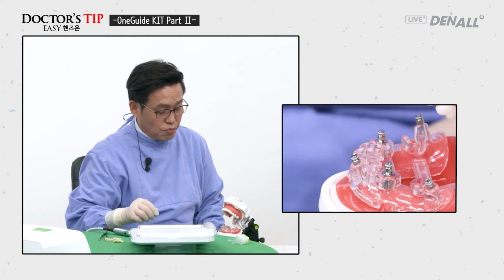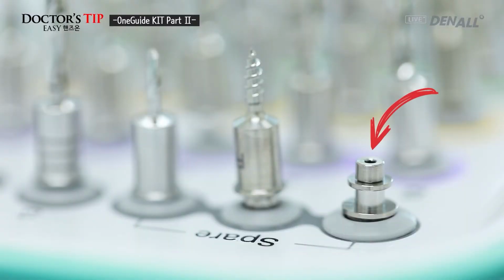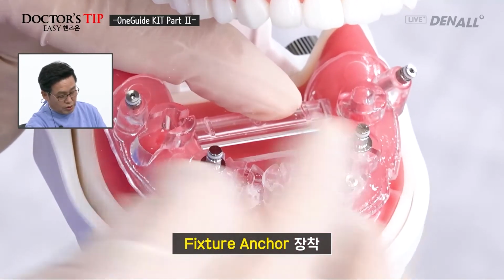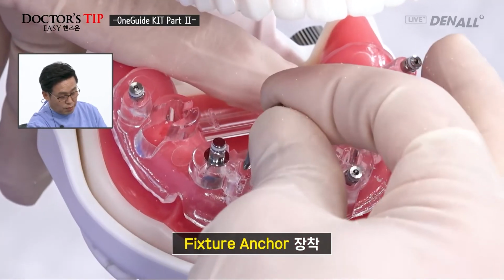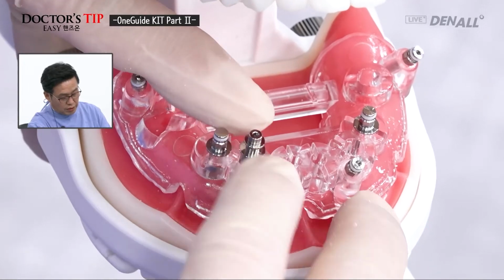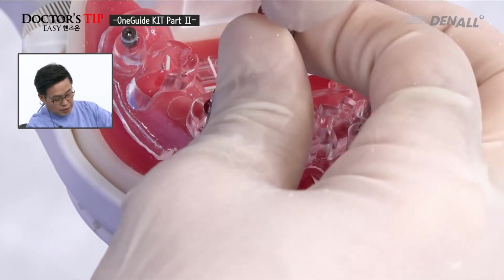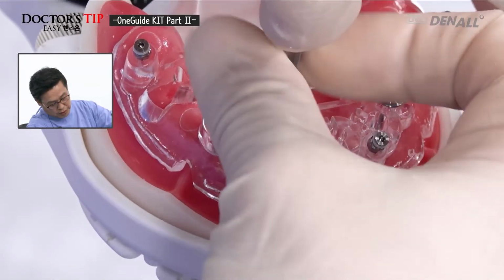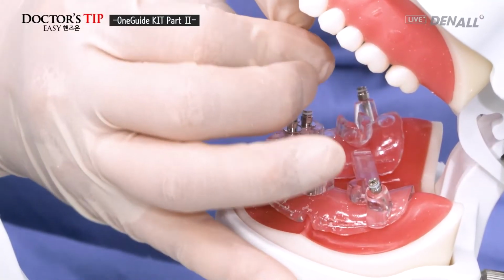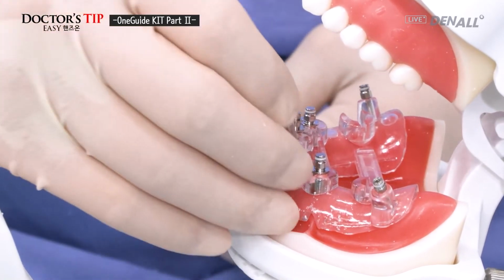Both canine sites implants have been placed, and as I mentioned earlier, because there's fixture anchor, I'm going to connect the fixture anchor on both canines. It's in. Yes, we can proceed, and it's already fixated, but I can show you. In order to do fixture anchor, vertical anchor is connected, and driver is used. 12 millimeter driver is used. Using the fixture that has been placed, you can see that vertical anchor is being connected. This is the same for number 33.